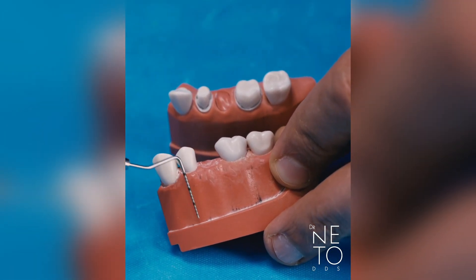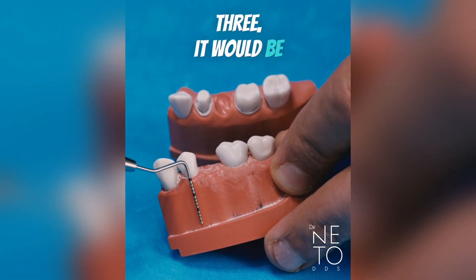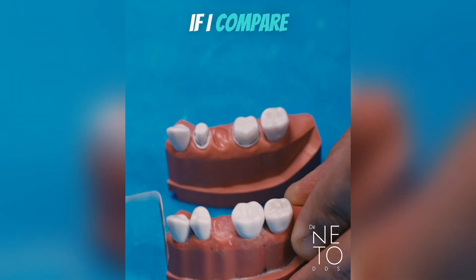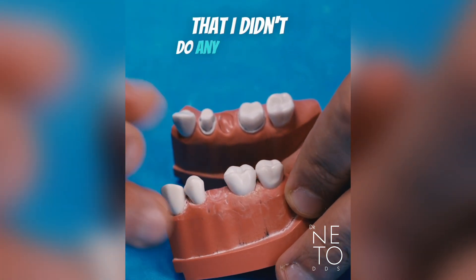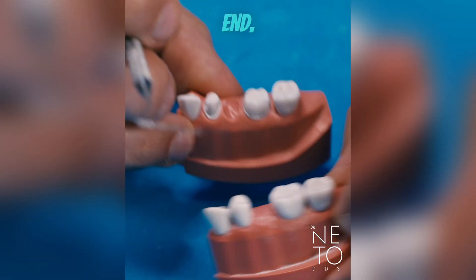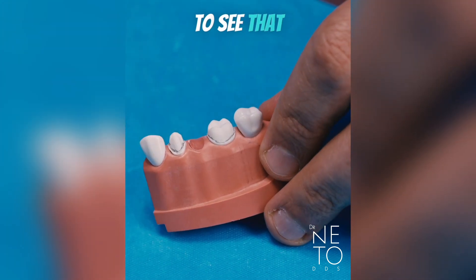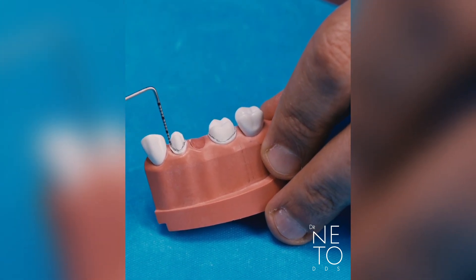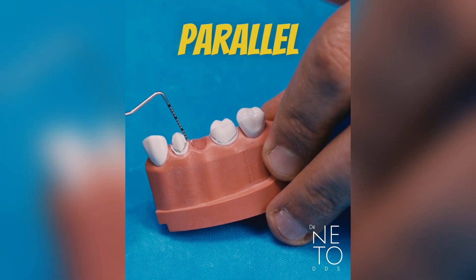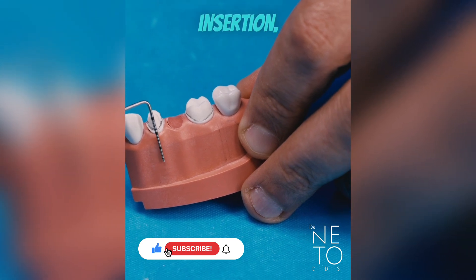Number five is tilted like this, and if I do a vertical line parallel to number three, it would look something like that. You can compare this model where I haven't done any preparation — you see that number five is tilted — but at the end when I finish my preparation, they are going to be parallel. Mesial is parallel to mesial, distal is parallel to distal, and they have the same path of insertion.